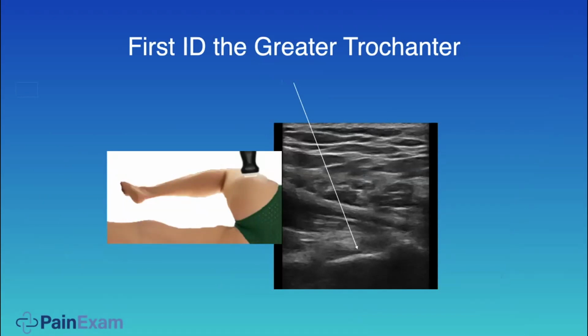We're talking here about finding the bony landmarks. We talk about the ischial tuberosity. Here we're talking about the greater trochanter, which, by the way, just happens to be another spot that us pain doctors like to inject. So this is what the greater trochanter looks like under ultrasound. If it's in this orientation, this may be tensor fasciae latae going above the trochanter to insert, or it could be another muscle. Lots of muscles insert on the greater trochanter, such as gluteus medius.